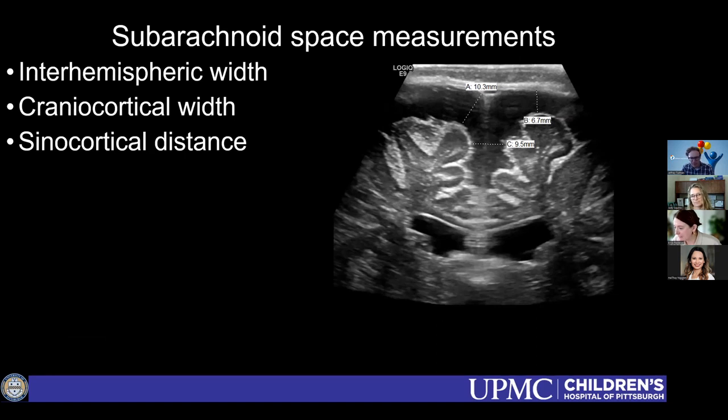And then the other tag-along question, I was curious, as far as the ventricles themselves, I think there's reasonable data for preterm infants to track ventricular indices. We use ventricular index for following the lateral ventricular size, and those go up to a post-menstrual age of 40-ish weeks. But if you have a term infant, 3, 4, 5, 6 months old, there's not really, as far as I know, a whole lot of data for normal ventricular size in a normal term infant. In that particular case, how do you guys describe whether the ventricles are normal or dilated? I struggle with that.